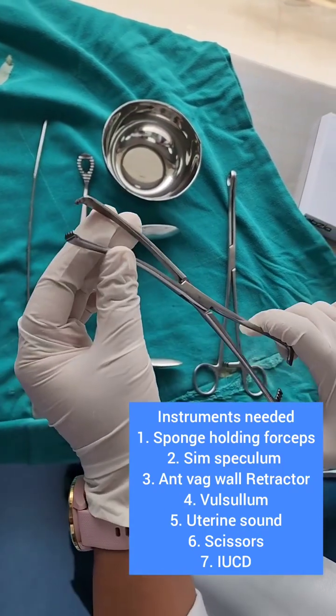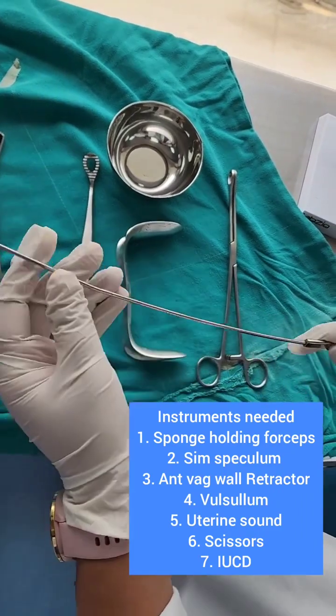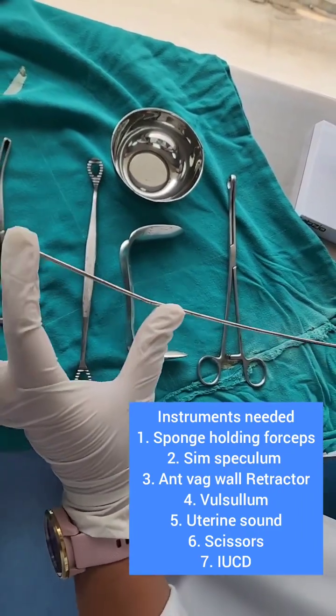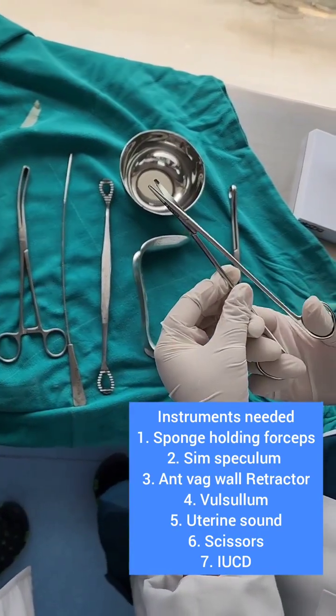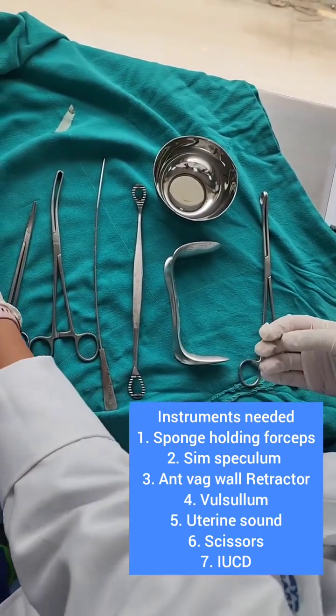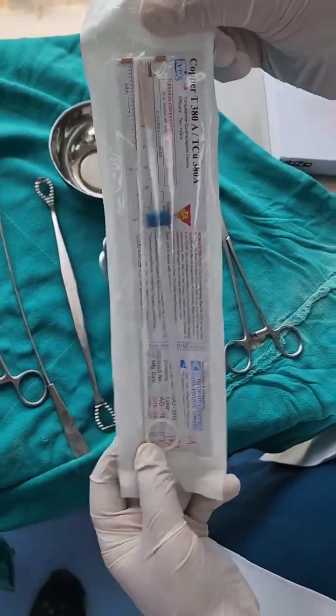Then we need something to hold the cervix — we can use a Valsellum or a tenaculum to hold the cervix. We use a uterine sound to measure the length of the uterocervical canal, and we need scissors to cut the thread of the copper T. And of course, we also need a copper T.